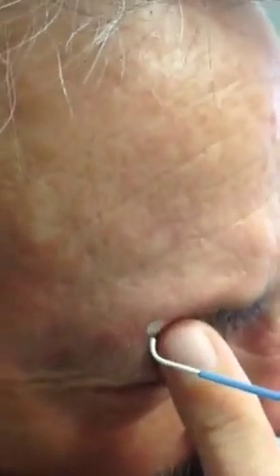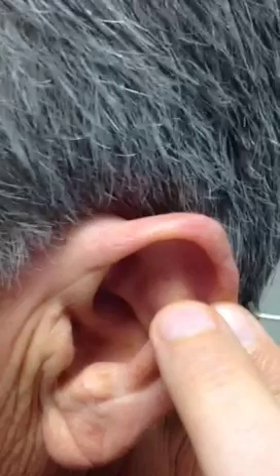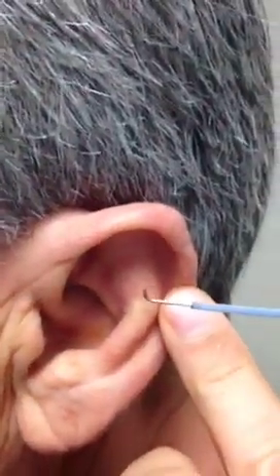I'm moving on to the second lesion here. I have to really feel it because I can't see it. You can see it's frozen — the skin is frozen white. Moving on to the last one on the ear. I want to feel it first — right there.